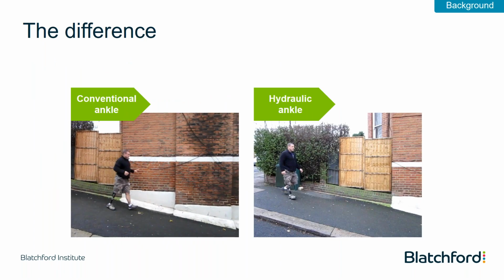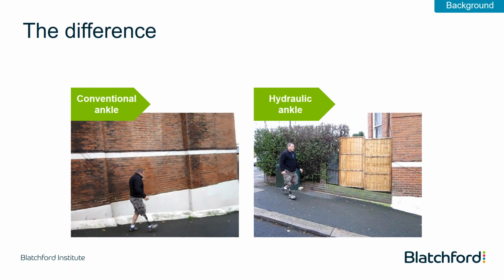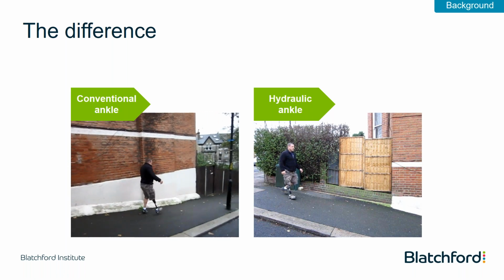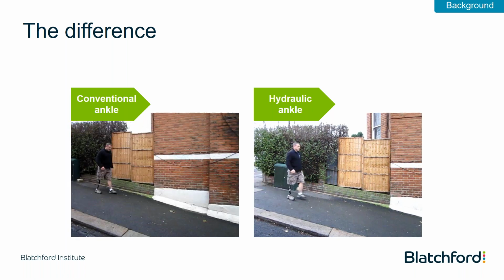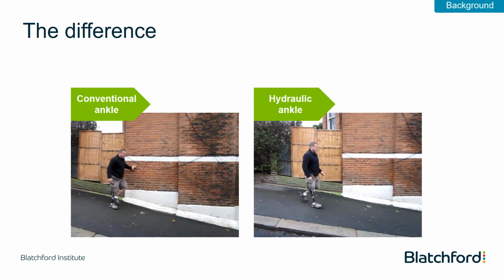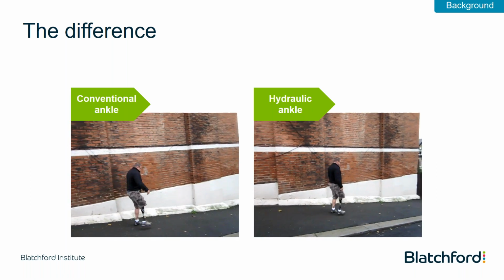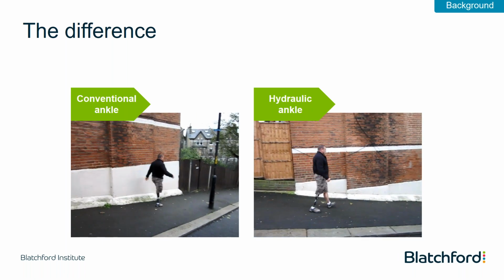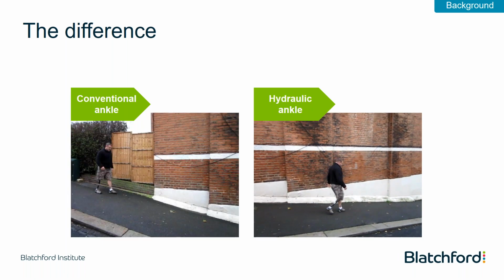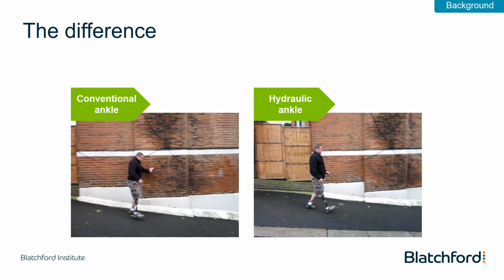So here we see an amputee walking down a hill outside our limb centre. I live and work in the highest point in London, and then we built the hill. On top of the hill, we dug a hole and built the limb centre. So walking down the hill, first of all, with a fixed ankle. A conventional ankle does not conform to the ground, so we can see the patient is unstable. He's having to compensate for this, dig the heel into the ground, and try to keep himself safe.